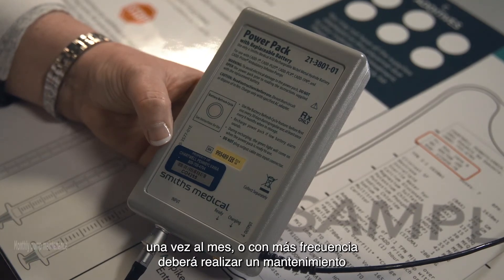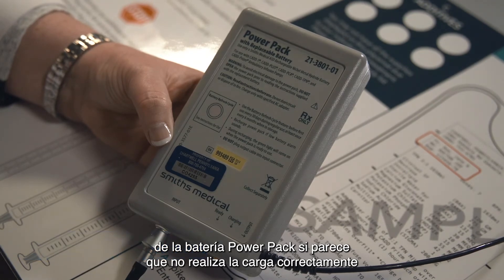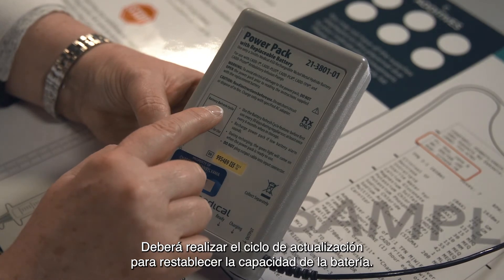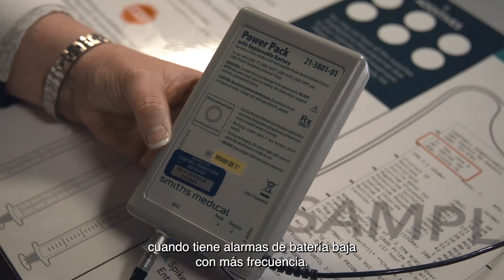Your power pack will require monthly maintenance. Once a month, or more frequently if your power pack is showing signs of not holding a charge, you'll need to use the battery refresh cycle to restore battery capacity. You will know your power pack is not holding a charge when you have more frequent low battery alarms on your pump.